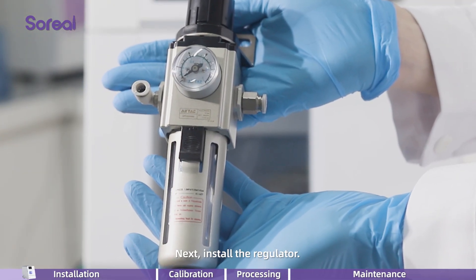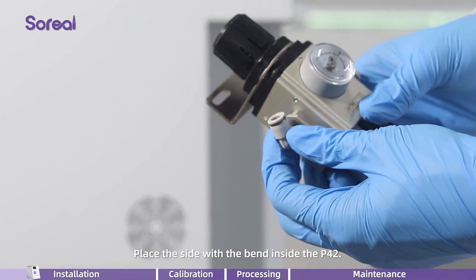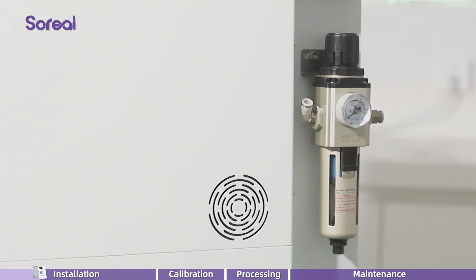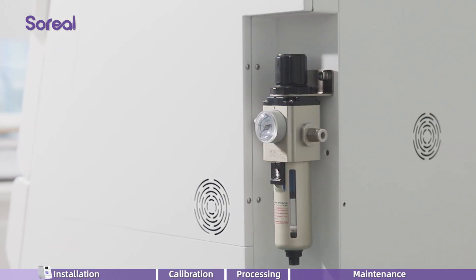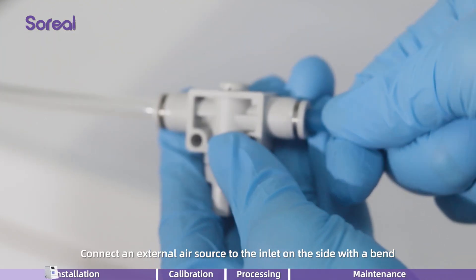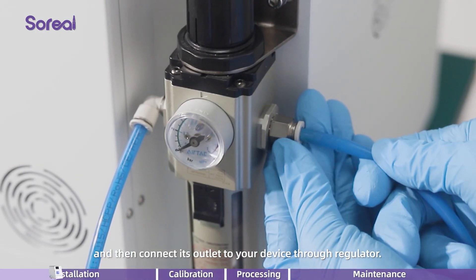Next, install the regulator. Place the side with the bend inside the P42. The left side is for inlet, while the right side is for outlet. Connect an external air source to the inlet on the side with a bend, and then connect its outlet to your device through the regulator.